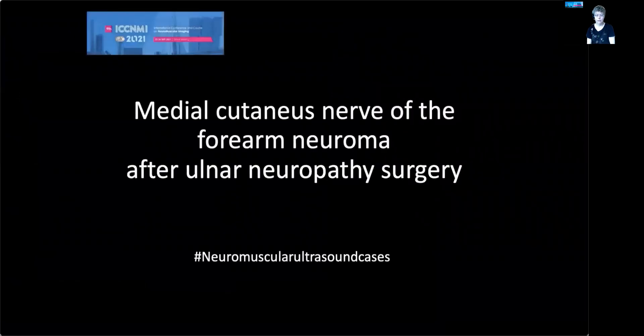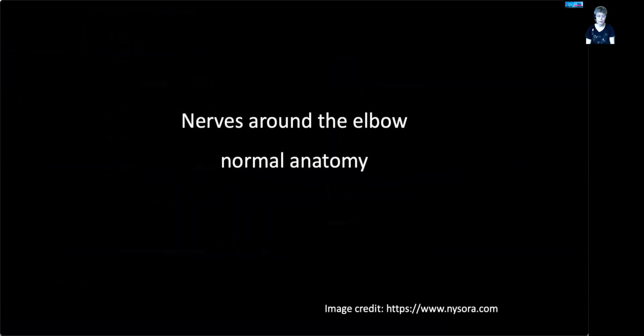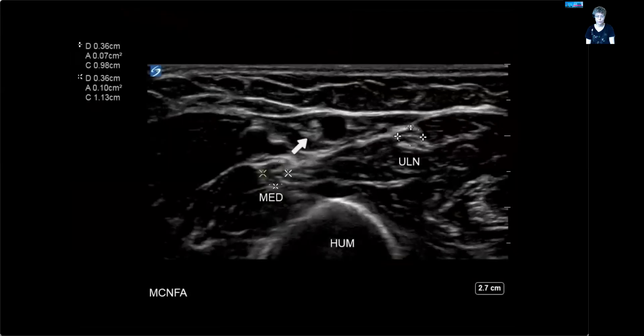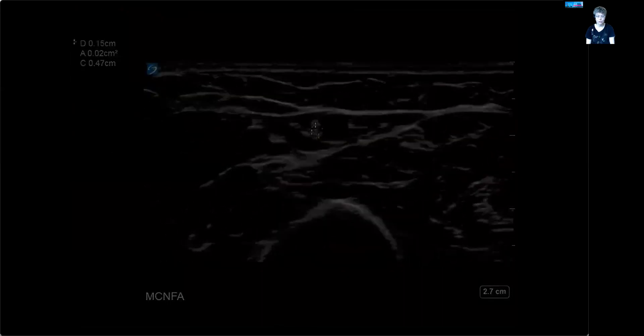Let's move on to the case of medial cutaneous nerve injury. It's someone who has had ulnar neuropathy surgery multiple times, and after the third attempt there was pain and hypersthesia in the region of the medial cutaneous nerve of the forearm. Just to remember, this is the normal anatomy — the image credit is for the NYSORA site, which is very useful for nerve ultrasound. Here's a small recap of the normal ultrasound anatomy.